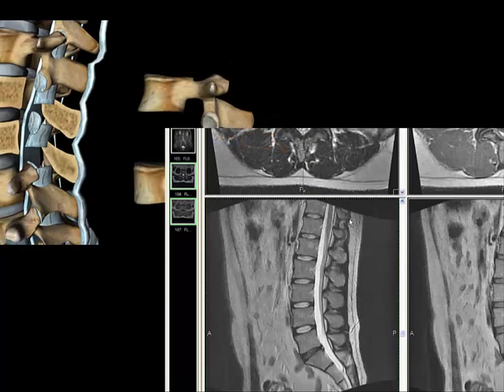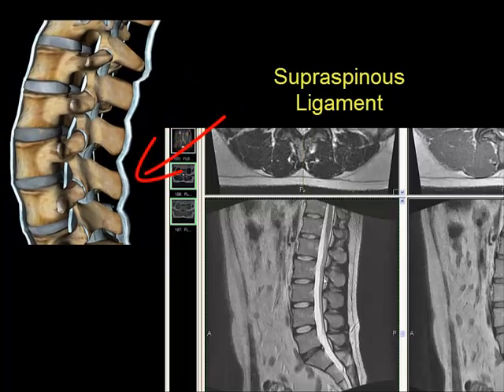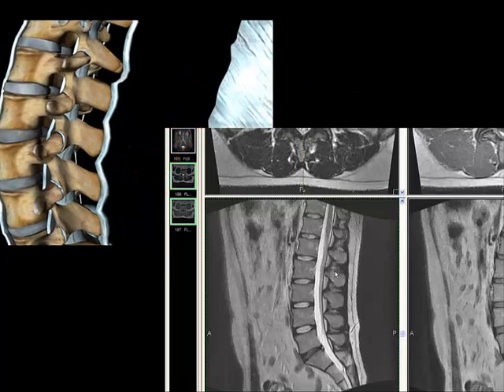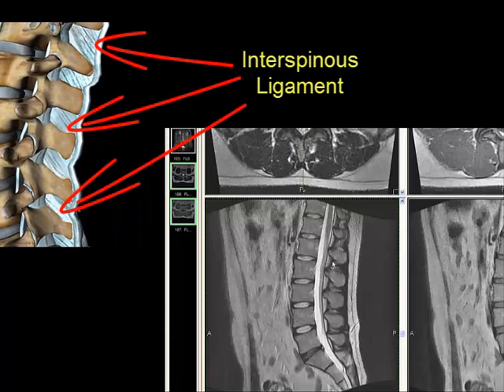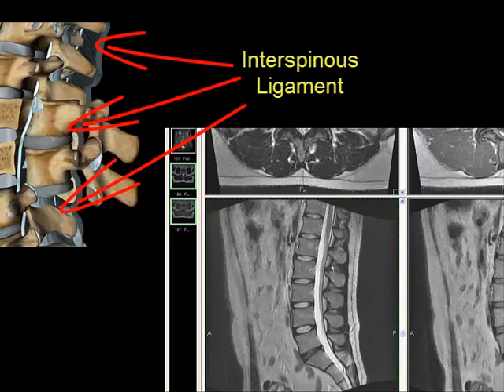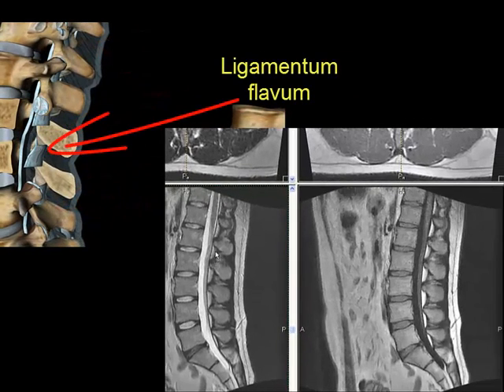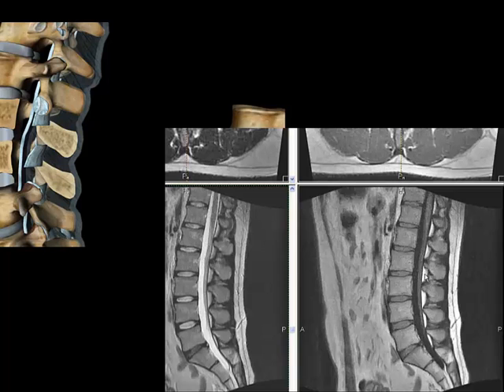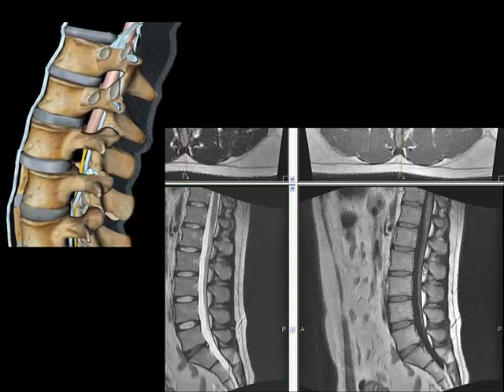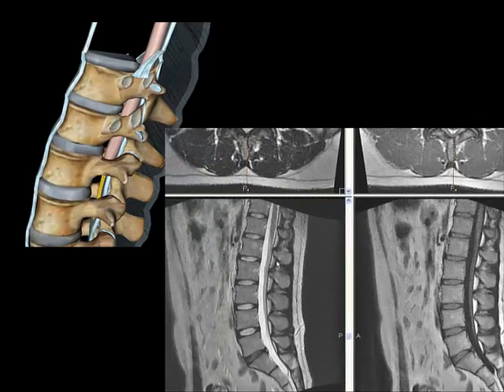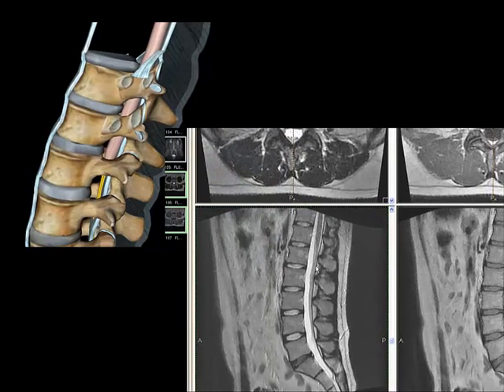Superficial from that is the supraspinous ligament. Here's the interspinous ligament. And then this is the ligamentum flavum here. Deep to that is going to be fat — the epidural fat, or the epidural space. And then we encounter a membrane that you see best here, and that's the dura and arachnoid of the thecal sac.